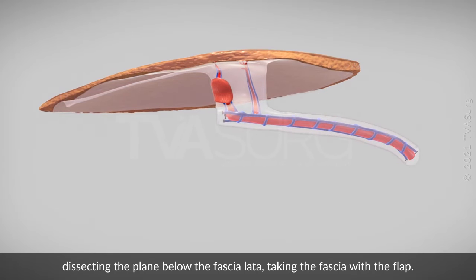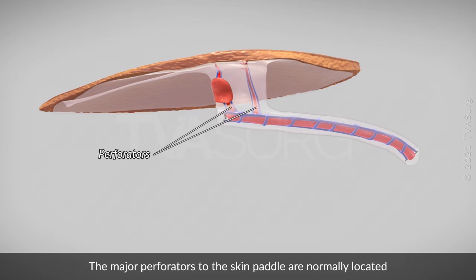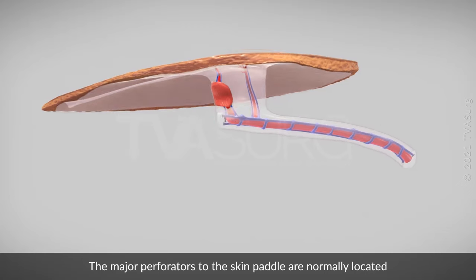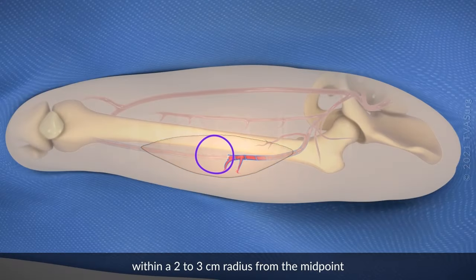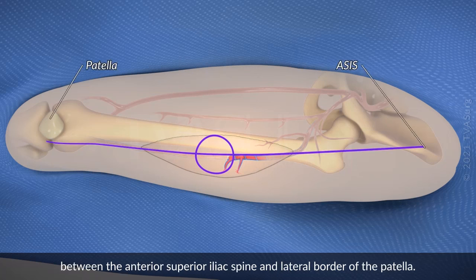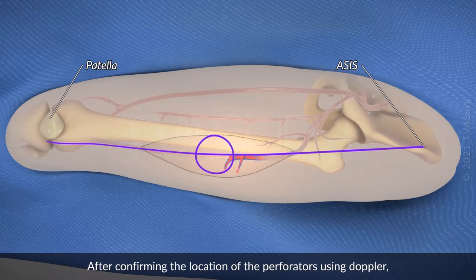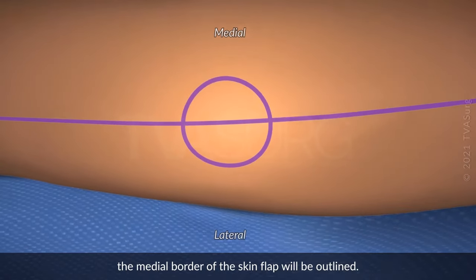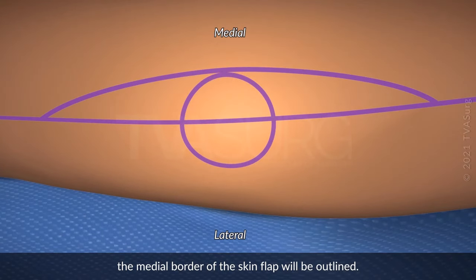Dissecting the plane below the fascia lata, taking the fascia with the flap. The major perforators to the skin paddle are normally located within a 2-3 cm radius from the midpoint between the anterior superior iliac spine and lateral border of the patella. After confirming the location of the perforators using Doppler, the medial border of the skin flap will be outlined.